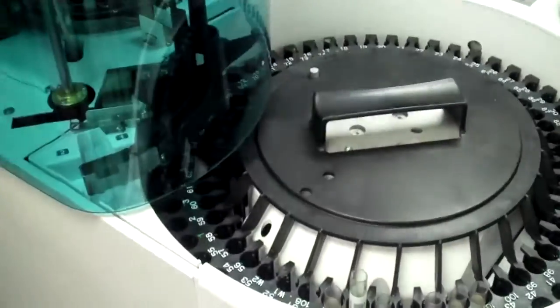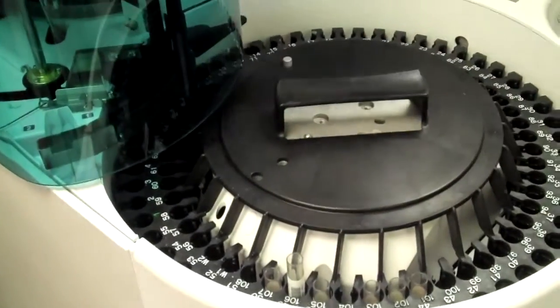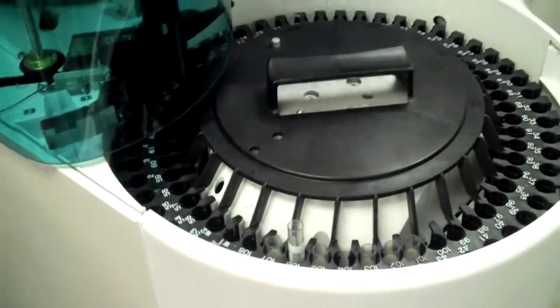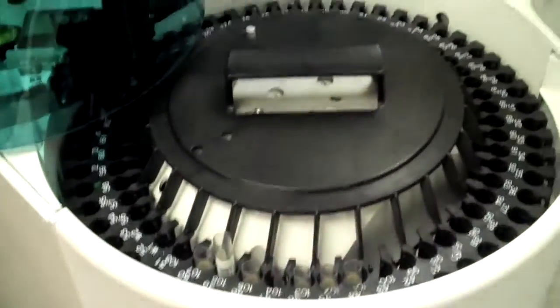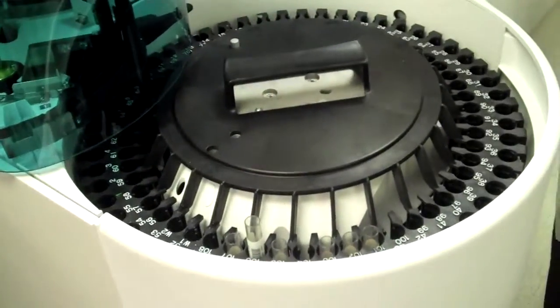A bigger lab would probably have all these full here if they were coming in by the rack, but like I say, we send most of our outpatient work out. So the few we do get are stats, and we just keep using these same positions. Also, to save paper, they've set it up so it doesn't print a report on everything. It only prints it on the stat people. So if you want a paper report you can hold in your hand and look at, you need to use one of these holes. Otherwise you're not going to get a written report.